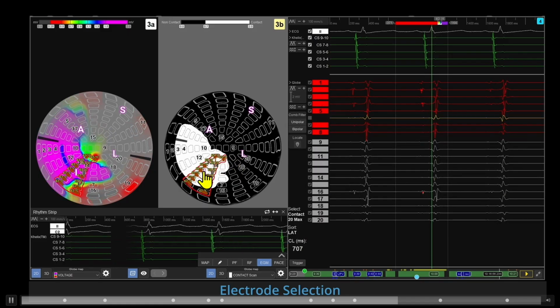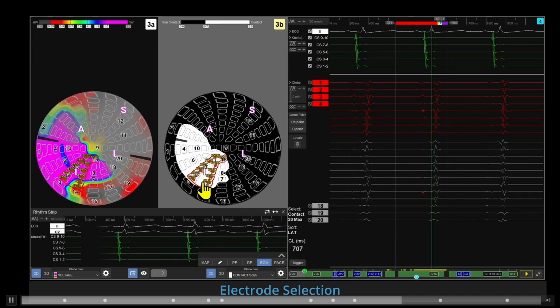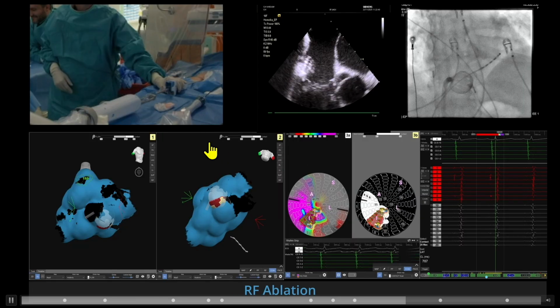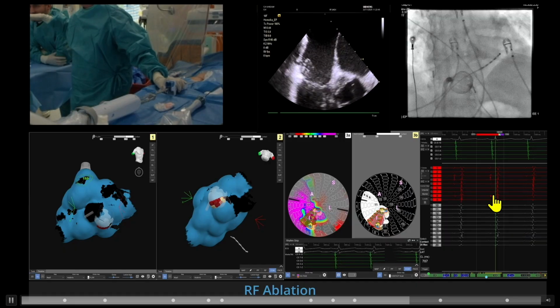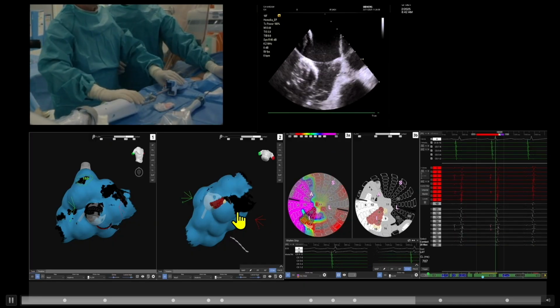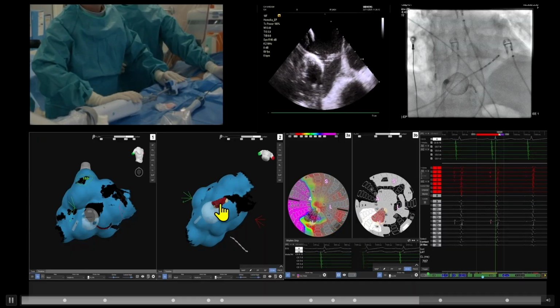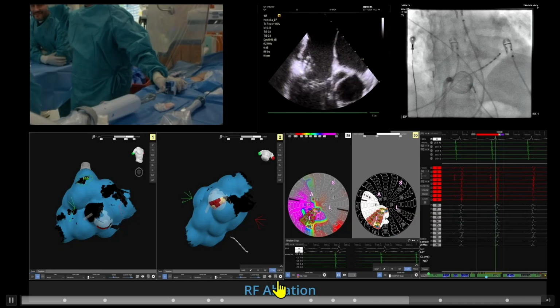And then we can select, and again, we like to select 2 rows of electrodes, whether it's PVI or linear lesion or whatever. You can also, by the way, select any of those electrodes and look at the electrograms during any of the tachycardias or whatever. So we're going to put this in this location, and once we like the location, we actually deliver RF energy. That's the red right here, I think. Is that right? I'm pretty sure we did. Yeah, we did RF ablation.